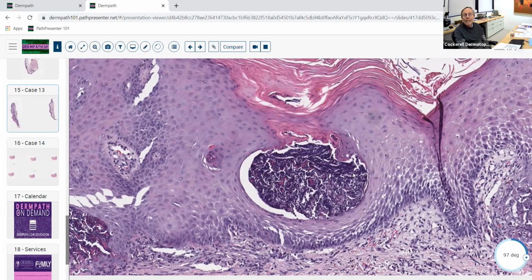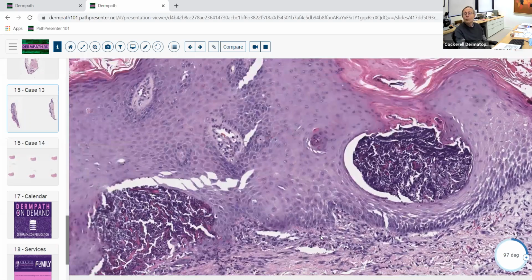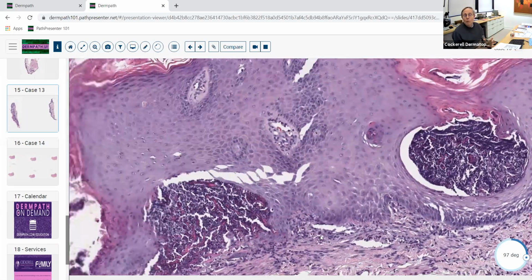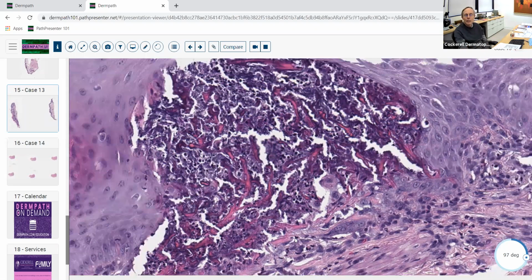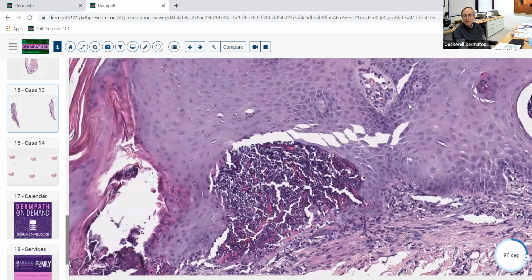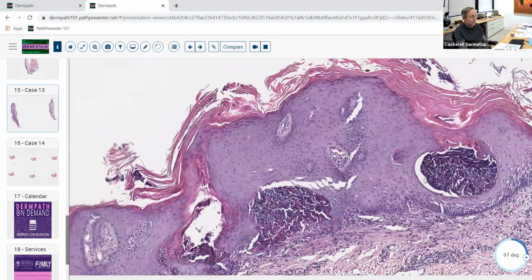So this is elastosis perforans serpiginosa in this case. And perhaps this was a real situation where the patient may have had Down syndrome or something like that, and these elastic fibers here were biochemically altered in vivo, and then they get transepidermally eliminated in this one specific disease. But you can see there's even some epidermal hyperplasia and rubbing here, so there's probably a component of that even in this disorder.